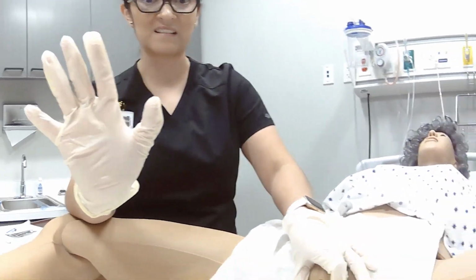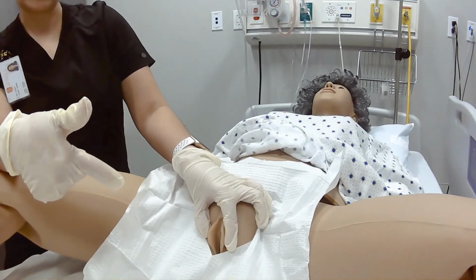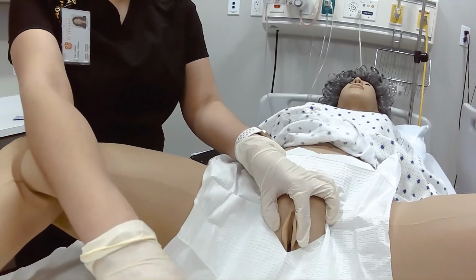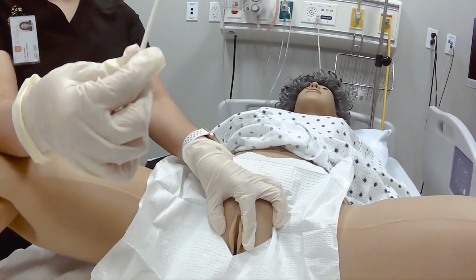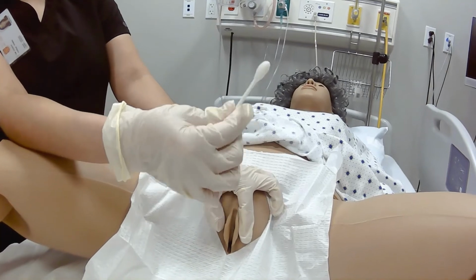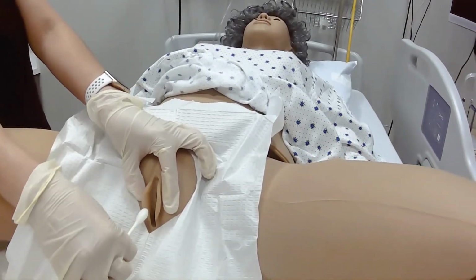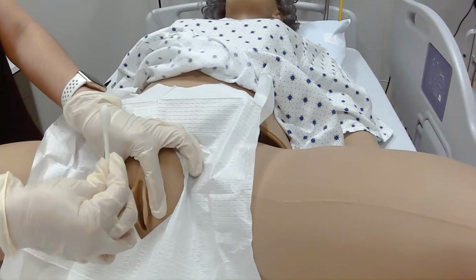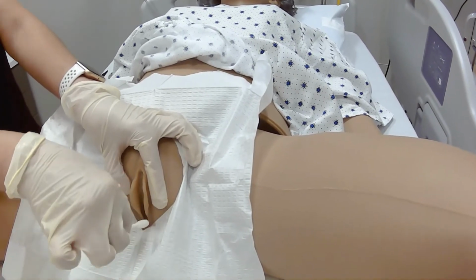Okay, because that is the only hand that is sterile at the moment. So I need to make sure that the labia are open. And with my sterile hand, my right sterile hand, I'm going to grab one of the swab sticks and I need to clean from distal to proximal to medial. Okay, so top to bottom, one wipe per swipe. Okay, or one swab stick per wipe. So top to bottom, we're cleaning the labia, top to bottom.